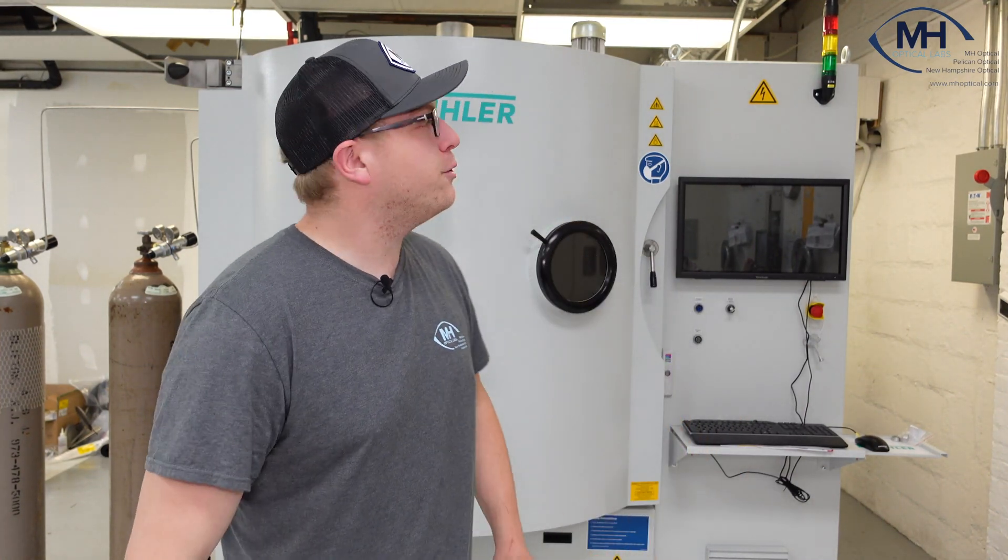Hey ladies and gentlemen, and welcome back to our YouTube channel. Today we're introducing you to a brand new machine, the Buehler Cyrus 1100. This is our brand new AR coater, and this machine is going to be capable of doing 140 lenses at 70 jobs.